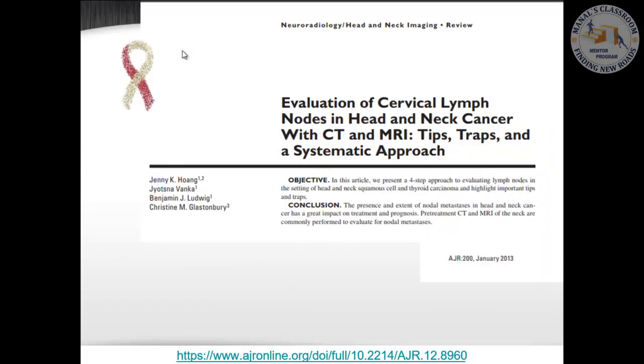My lecture is based upon an article published in the American Journal of Radiology in 2013 about evaluation of cervical lymph nodes in head and neck cancer with CT and MRI, tips, traps, and a systematic approach.